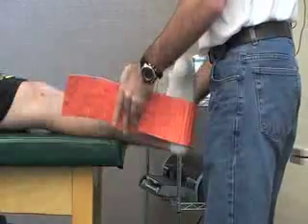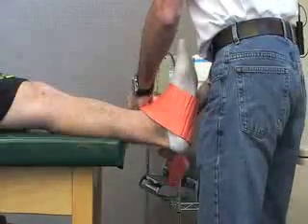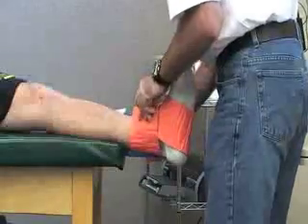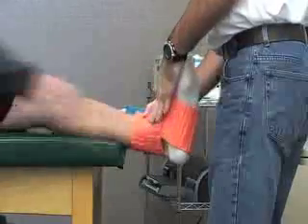Once we have that on there, basically what we're going to do is we're going to be doing a figure-8 across the top of the foot. Try to mold it as tightly as possible, just remembering that they do have an injury. Go ahead and hold that for me.